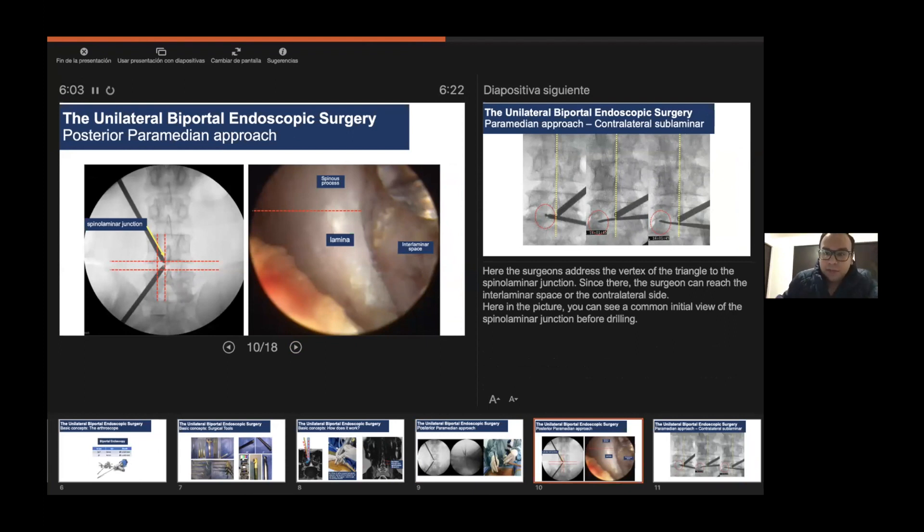However, most of the discectomy and central subarticular stenosis can be treated by this approach, the paramedian approach. Here the surgeon addresses with the vertex angle of the triangle the spinolaminar junction, since there the surgeons can reach the interlaminar space, the ipsilateral subarticular zone, and you can reach the contralateral side. This is a picture taken immediately after initiating the approach where you can see the spinous process, the base of the spinous process, and the lamino-spinous process junction.